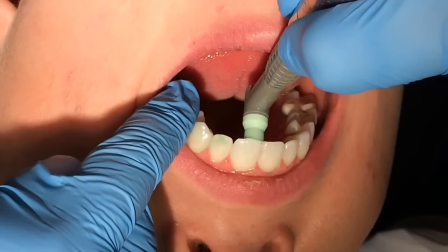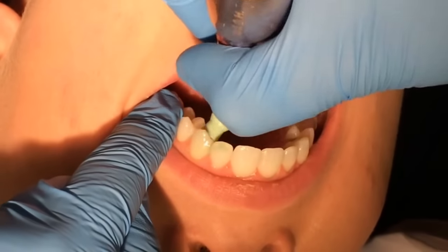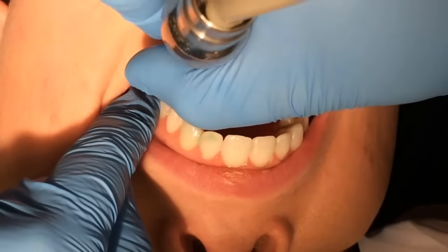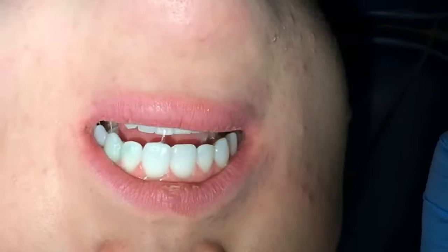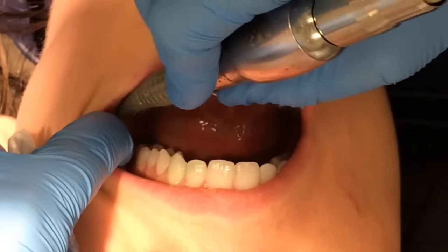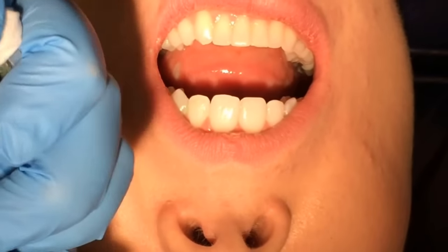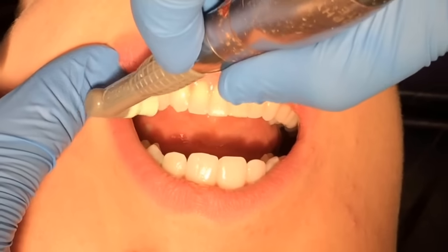If my patient presents with stain on the anterior lingual teeth, I'll use my mirror to take a look and make sure that I'm using the prophy polish as a stain remover. A lot of patients hate this and they hate to swallow it, so if my patient is filling up with water or saliva, I'll let them close on the saliva ejector.